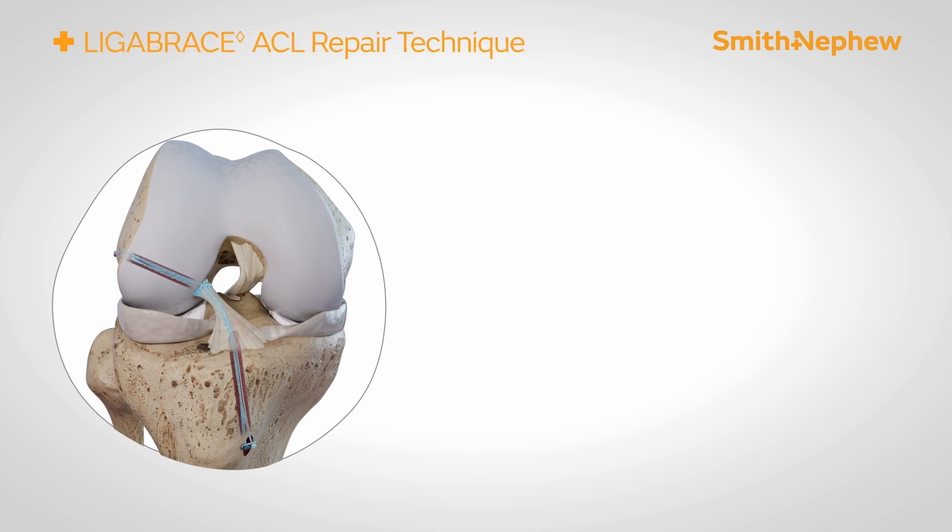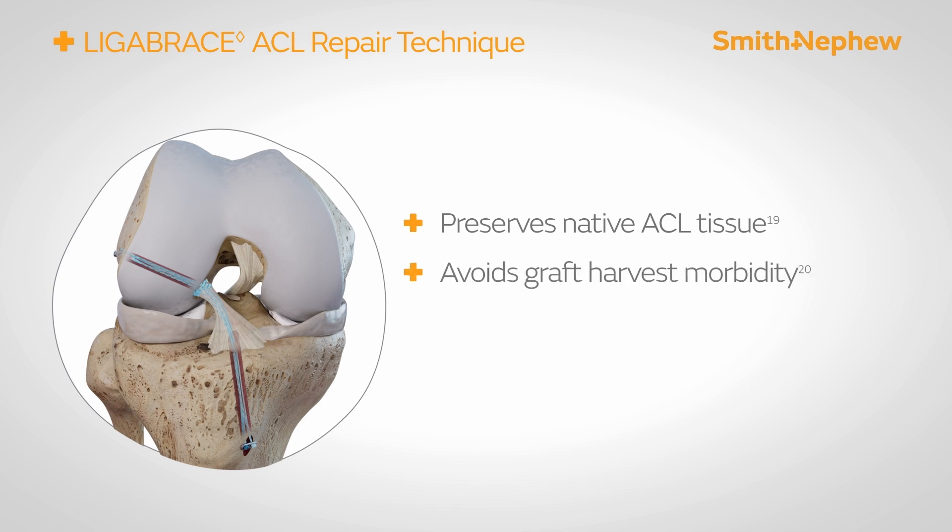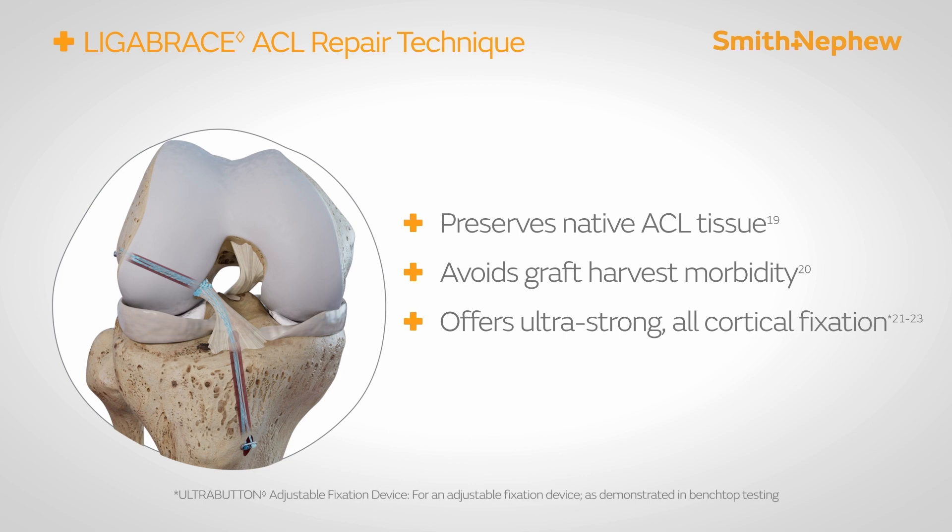The Smith & Nephew Ligabrace ACL repair technique enables a surgeon to preserve their patient's native ACL tissue and avoid graft harvest morbidity. It also offers ultra-strong fixation with the use of the ultra button.